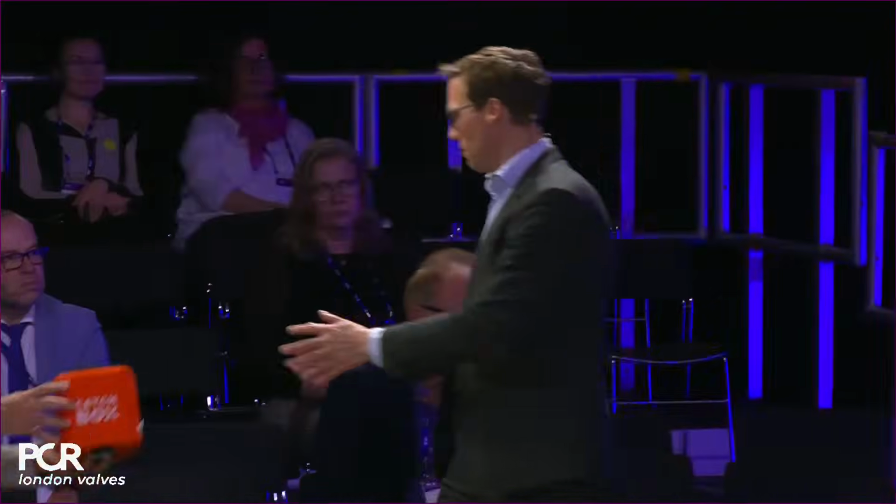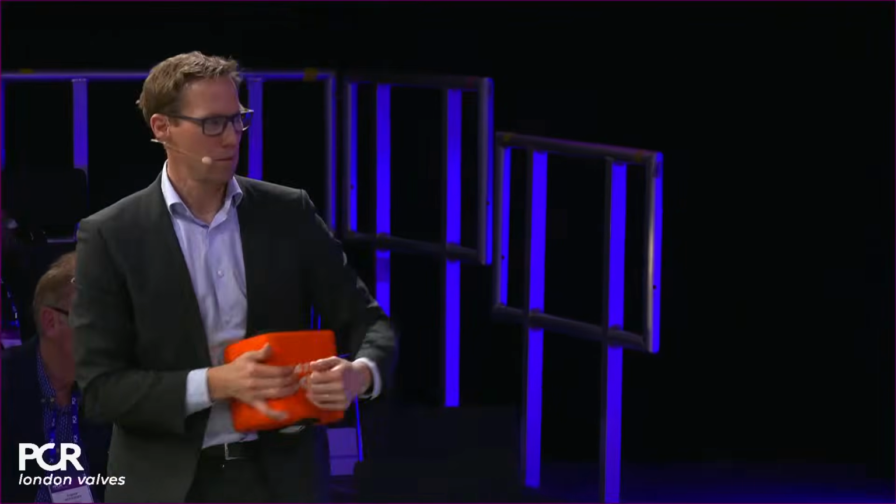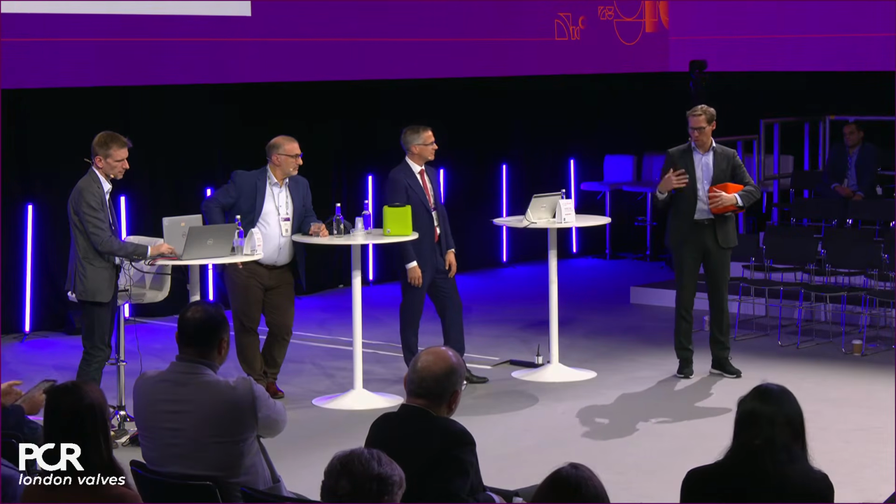You've got 18 seconds, so it's not bad. I'll do it in 18 seconds. But I think with the stiffer system or the stiffer wire, the question is whether the Lunderquist is the wrong wire. Yeah, because it's working against the FX. So this is something we have to learn, figure out. Yeah. And sometimes you think a Lunderquist is going to help me and it doesn't, and you switch it out.